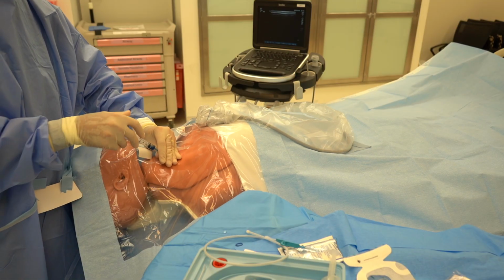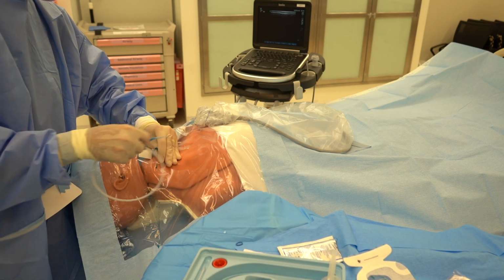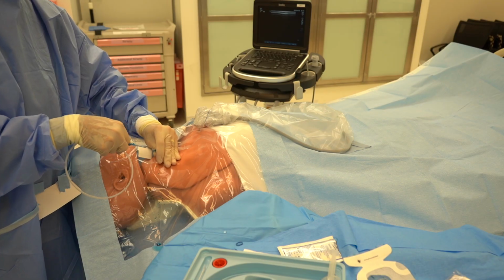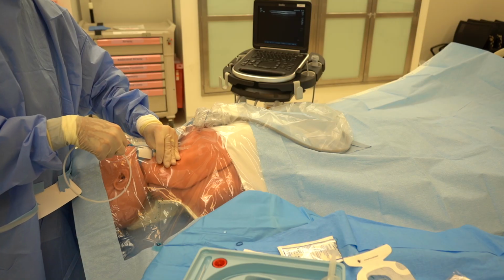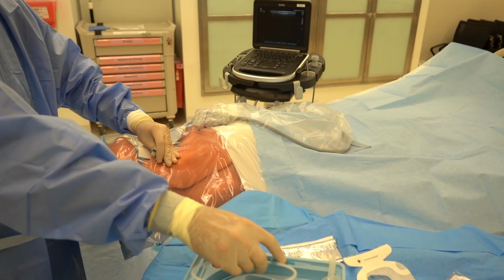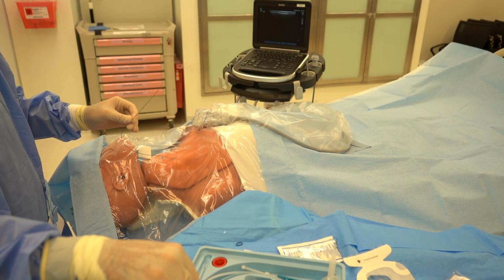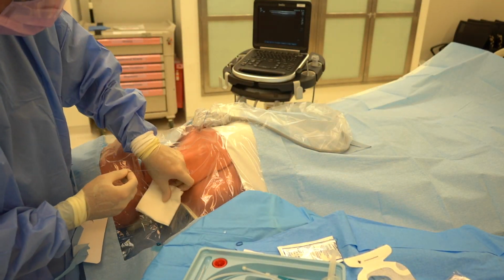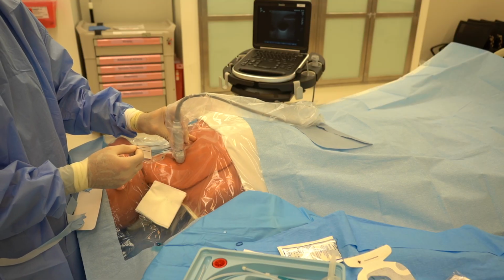We'll have good contact with the shaft to the patient's skin, and recheck our flow here. Grab our wire to start threading. And we're looking at our markings here. They can indicate to us if we have difficulty traversing certain numbers of where that challenge may be to circumnavigate that. And in this case, we'll have some gauze nearby for any particular bleeding.